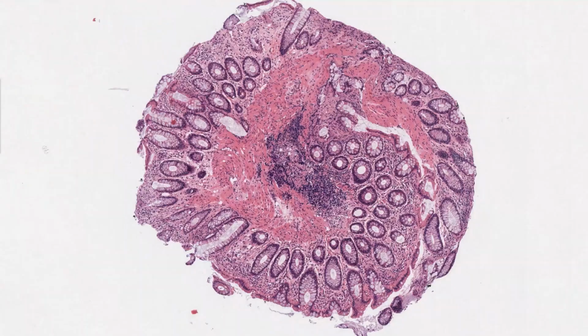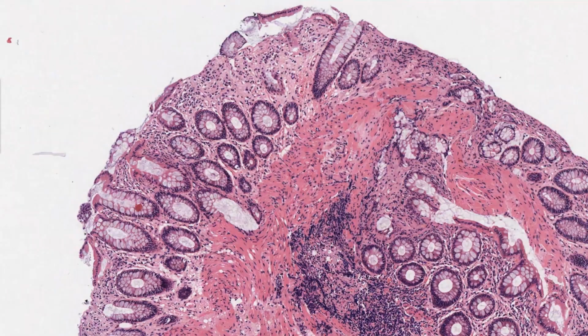And I just wanted you to look again here. This is another example of this, and it shows you how the lamina propria can become more eosinophilic in some areas. Normally, lamina propria will not be that densely eosinophilic, and normally the epithelium should not be ripped off like this.